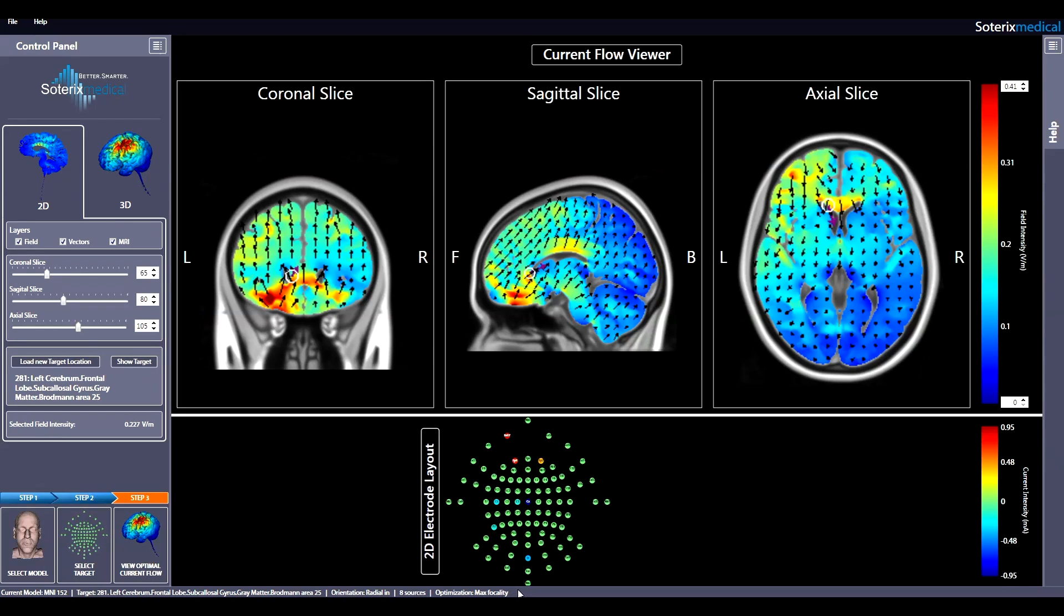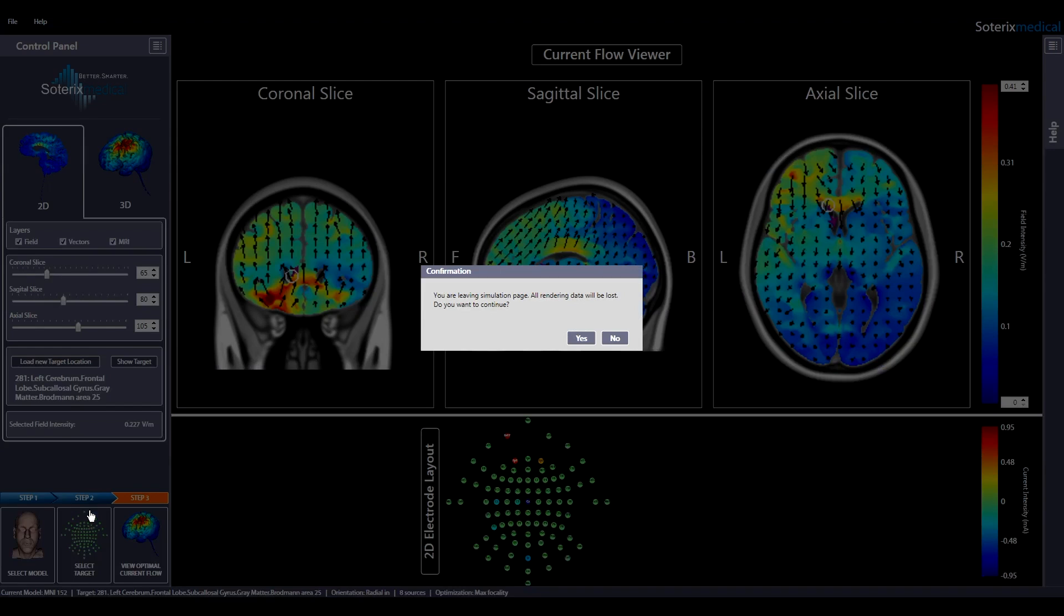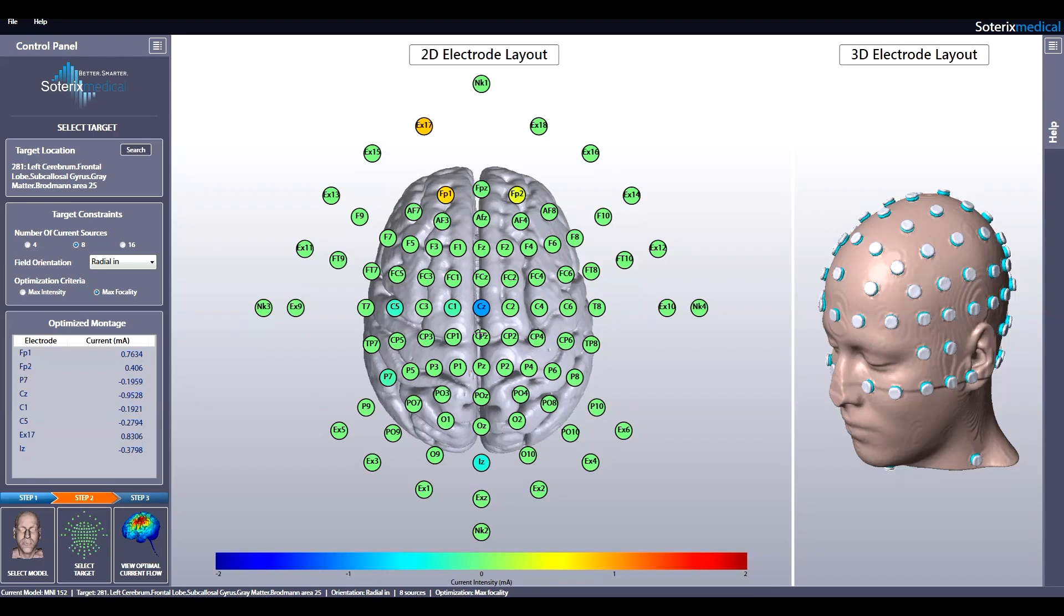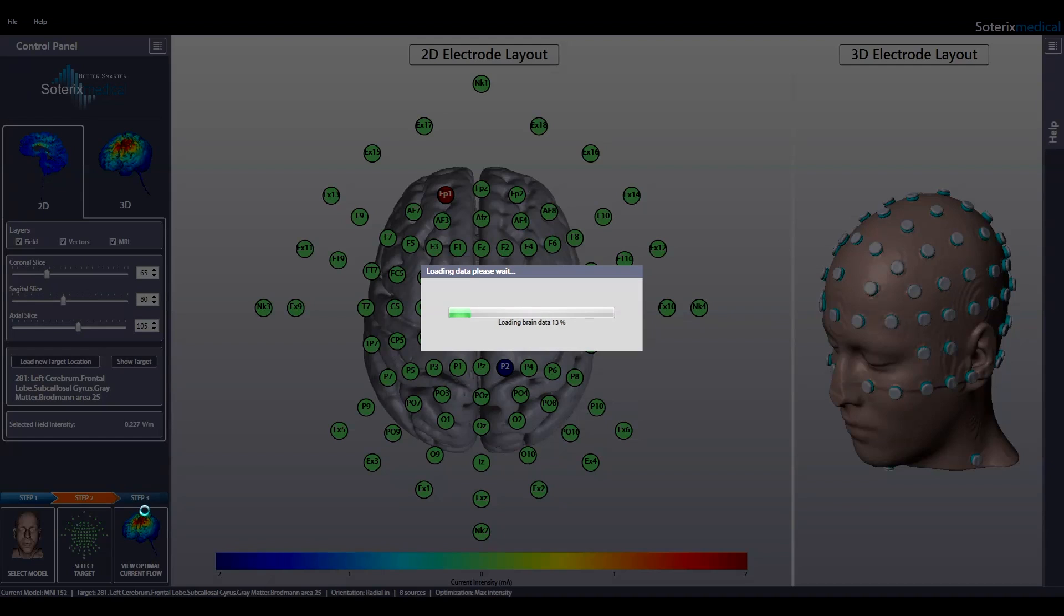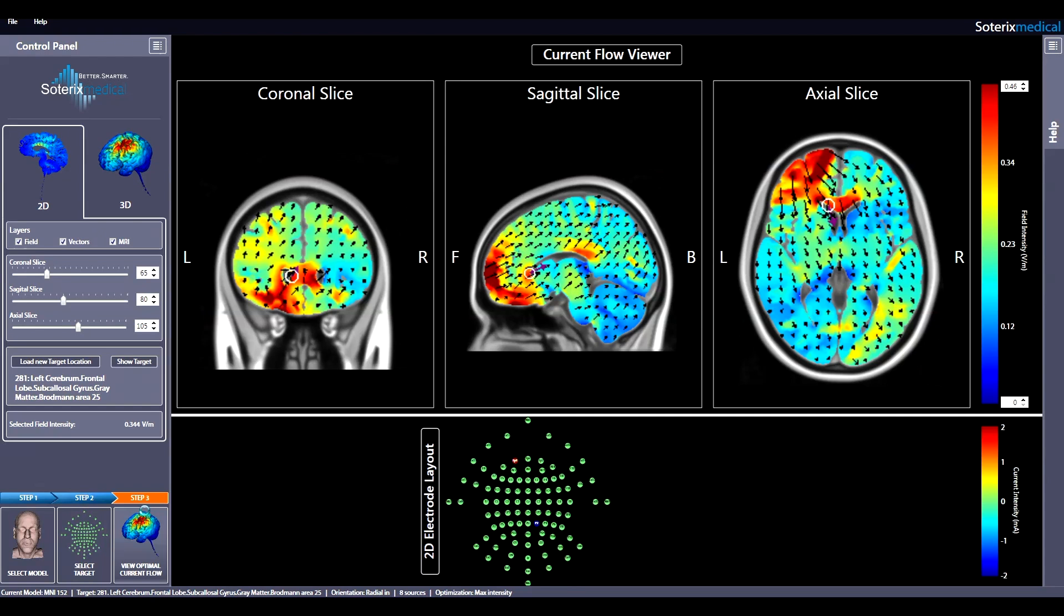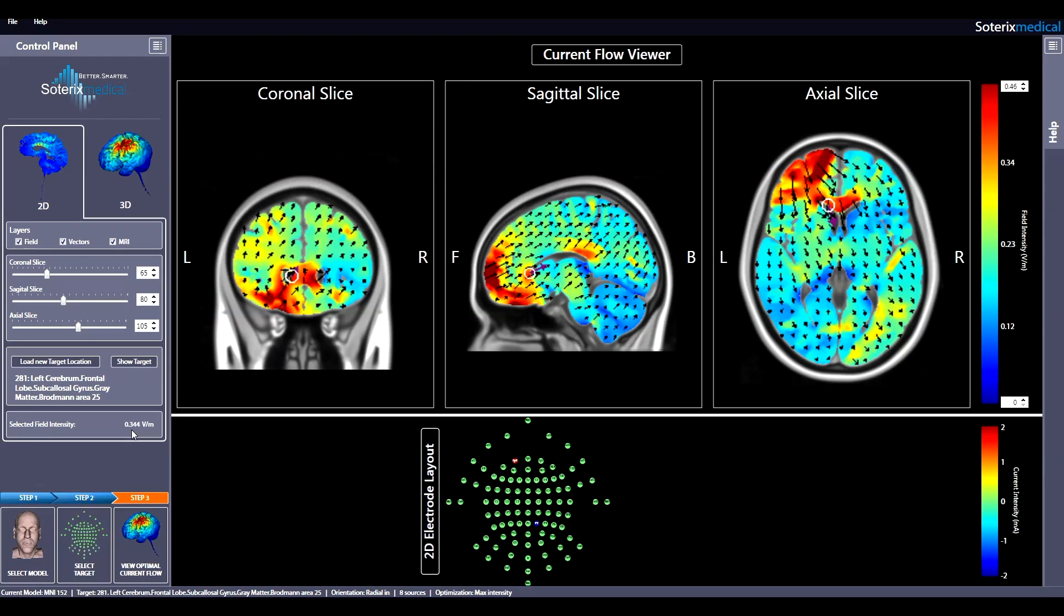To view predictions for the same target but with maximum intensity constraint, hit select targets, select maximum intensity constraint, and hit step 3, view optimal current flow as before. Note an electric field value of 0.344 volts per meter is induced at the desired target. This shows that the maximum intensity constraint induced more current flow in the target but will also lead to more current flow in other regions.